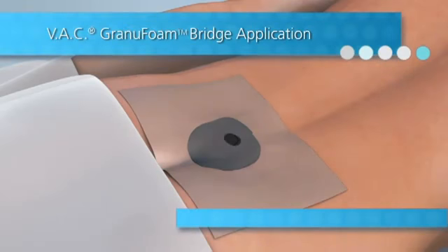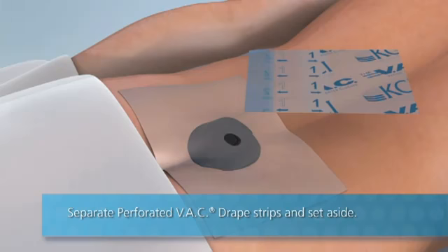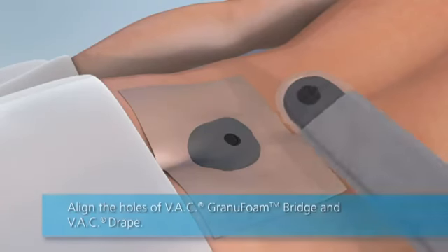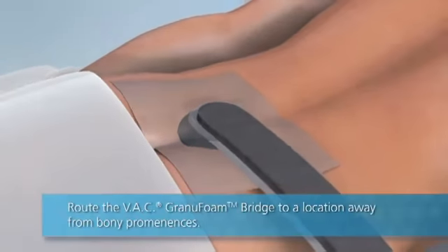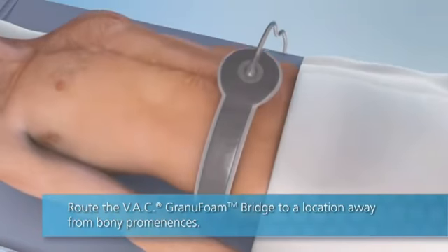V.A.C GranuFoam Bridge Application. Separate perforated V.A.C drape strips and set aside. Remove dressing release liner from the V.A.C GranuFoam bridge. Align the holes of V.A.C GranuFoam bridge and V.A.C drape. Route the V.A.C GranuFoam bridge to a location away from bony prominences.